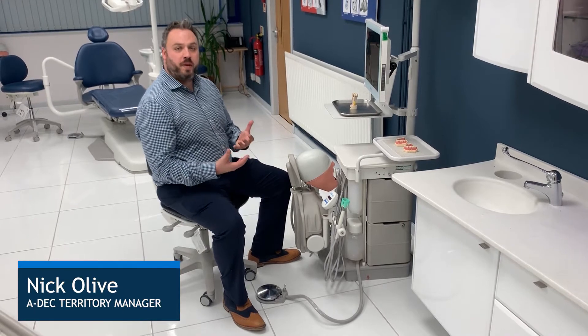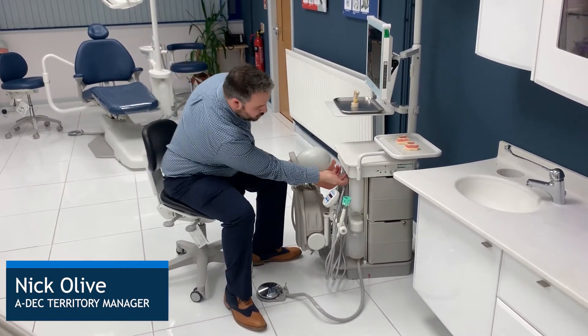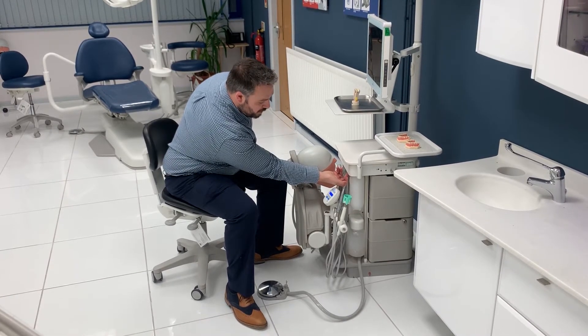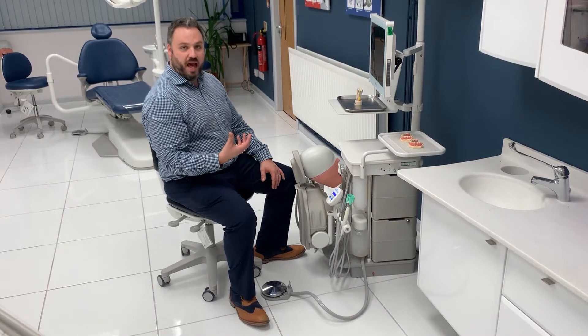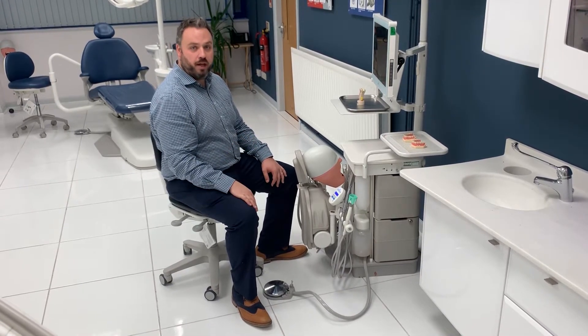Hi, I'm Nick from ADEC and today I'm going to show you the basic features of your ADEC simulator. To turn the simulator on, you have a switch just in the front of the simulator there, and you'll hear an air sound when this is switched on. If you do not hear air, then you do need to make sure that the compressor is working correctly.